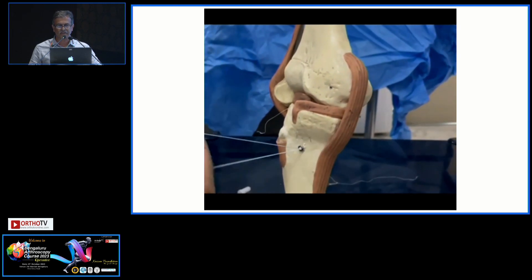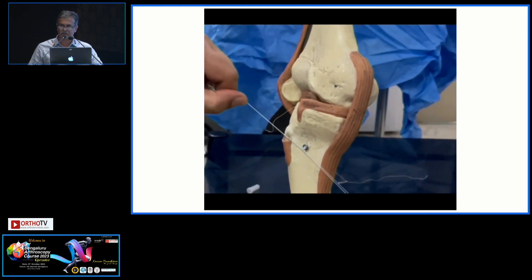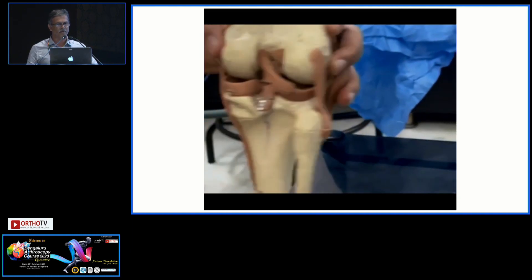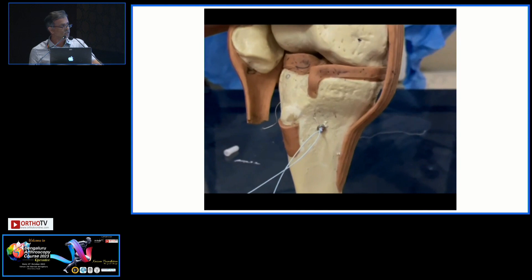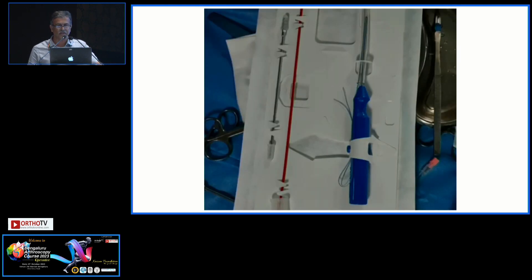The tunnel drilled here is only 3.5 mm, and there is a separate guide wire — probably 1.8 mm or 1.5 mm. This is how the button sits; it gives very good compression. That is the button sitting on the tibial end, and this is the implant which comes as a set.